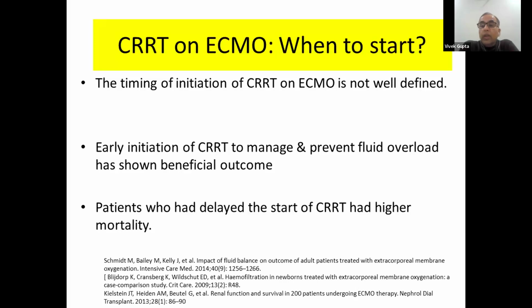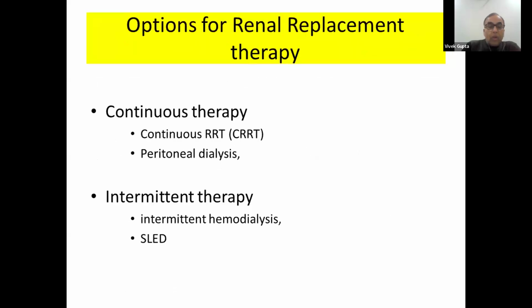So when to start? The actual time is not yet well defined, but yes, we believe that early CRRT may be beneficial, especially when we are trying to manage the fluid or correct the metabolic components. And delayed start of renal replacement therapy is always associated with a high mortality.